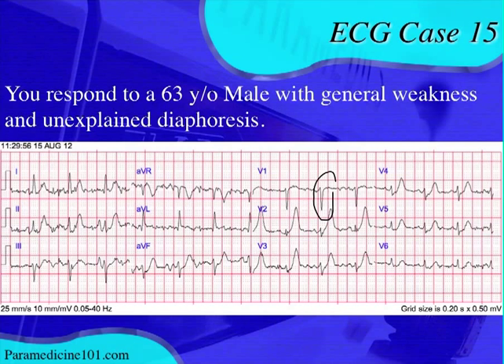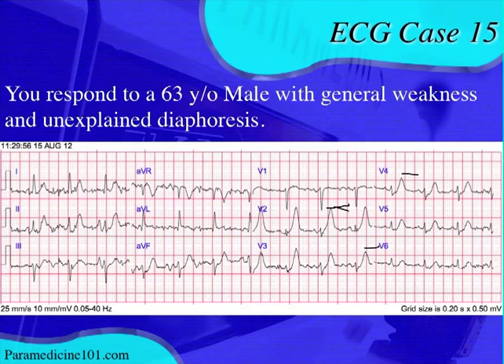Looking at intervals: the QRS complex appears narrow, the PR interval looks normal, and the QTc is pretty normal — nothing really abnormal there. However, the T waves look big — we have high-voltage T waves. Looking for ST segment and T wave abnormalities: this T wave is tall, has a broad base, and it is symmetrical. Symmetrical T waves are always due to pathology — they're never normal. It could be hyperkalemia or something else, but it is always something to consider.